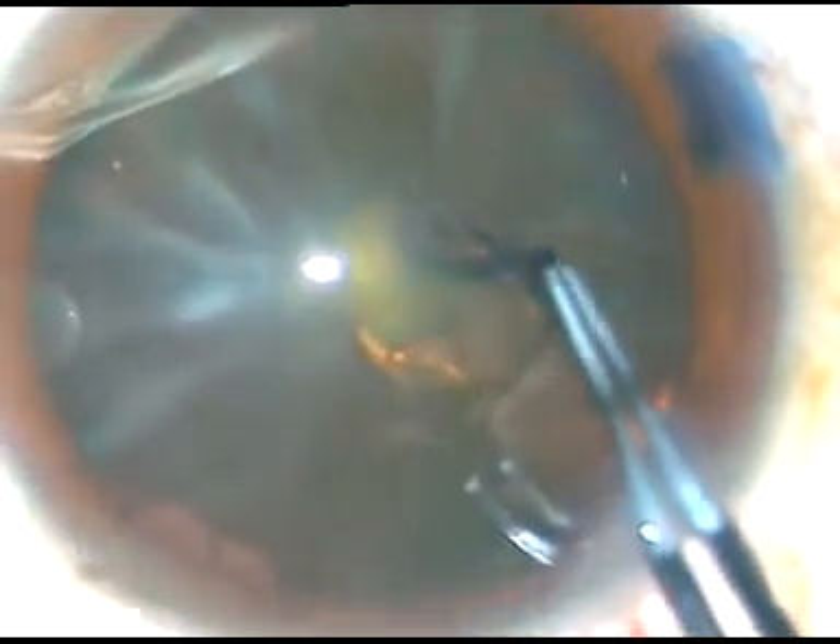Using a utrata forceps, holding this flap, going anti-clockwise, trying to remain at equal distance all around from the margin of the dilated pupil. And thus, I am getting a nice round capsulorhexis.